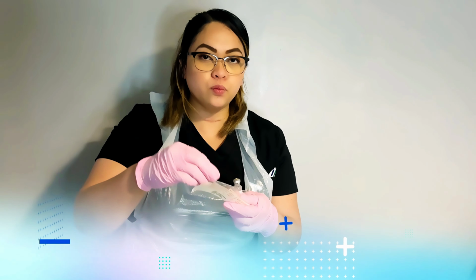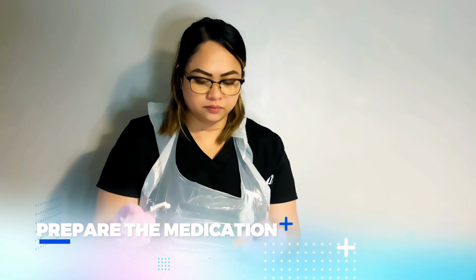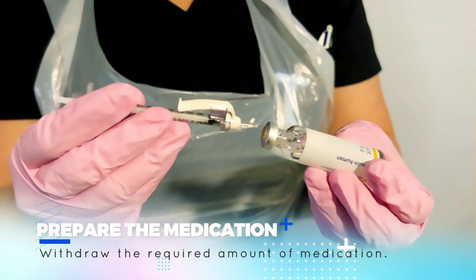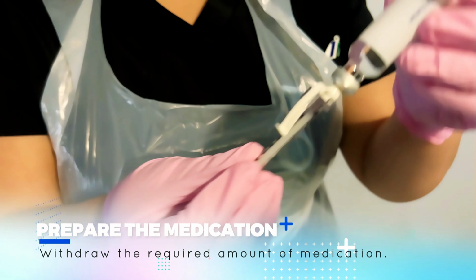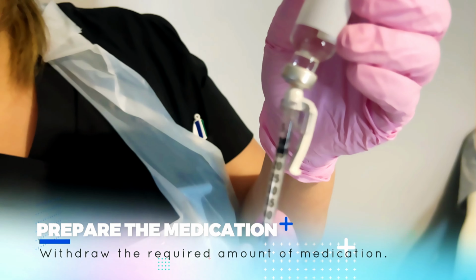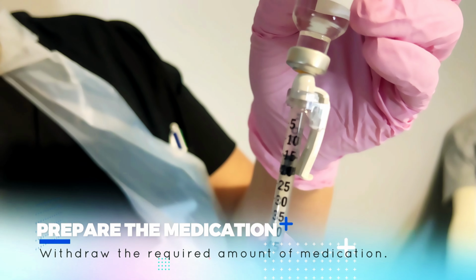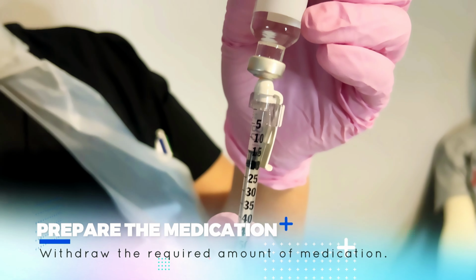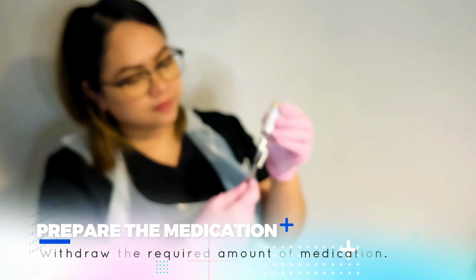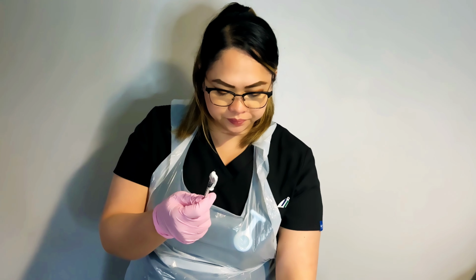Once it's dry, I'm gonna withdraw the required amount, which is 15 units, okay? So I got the 15 units.